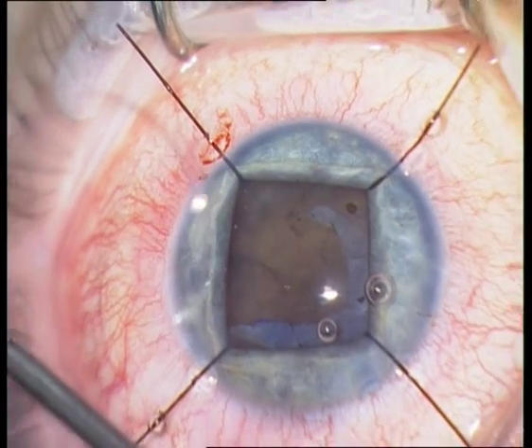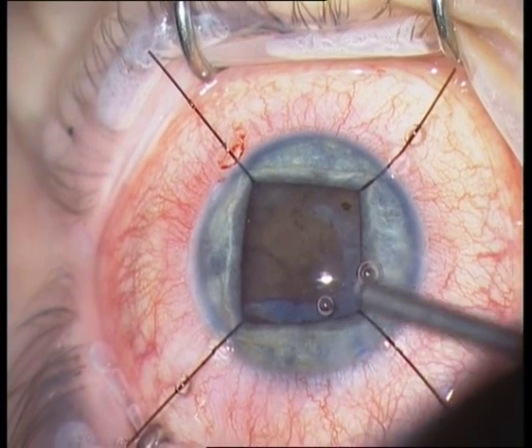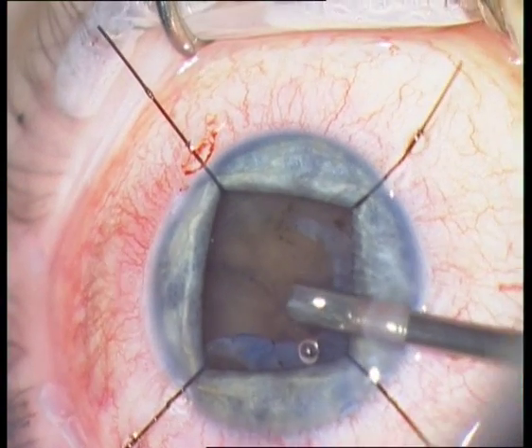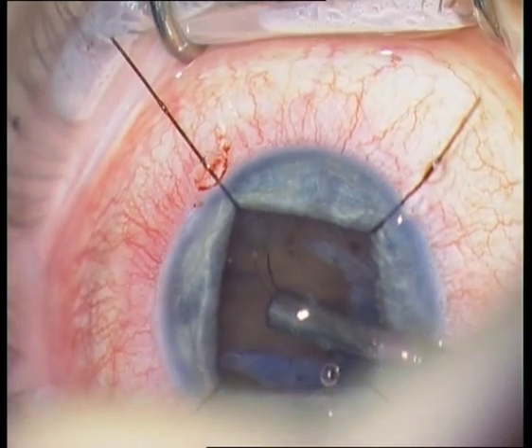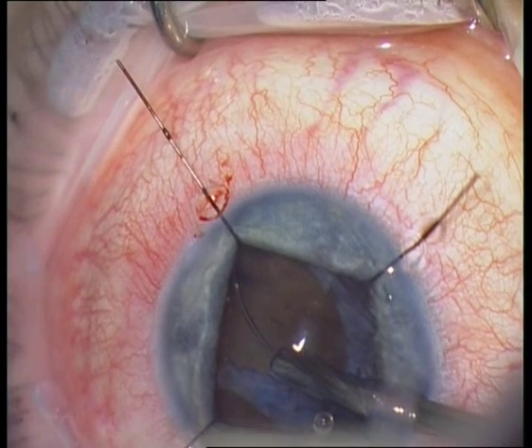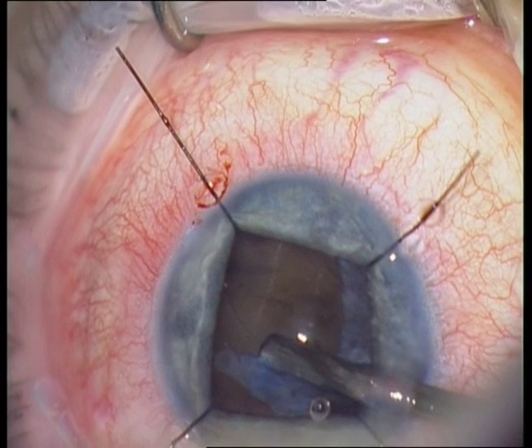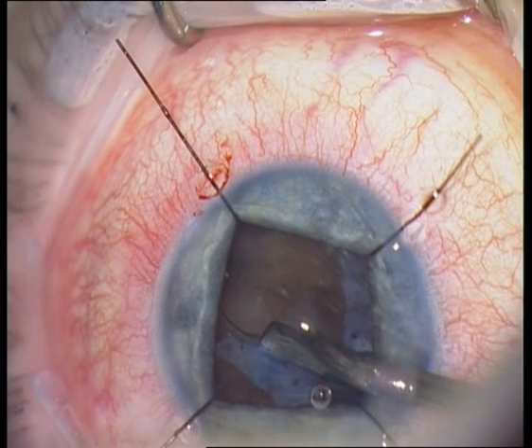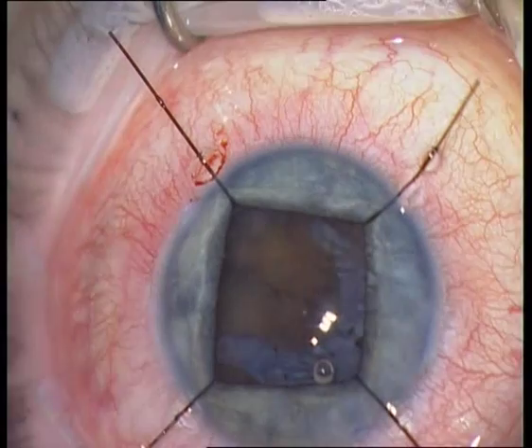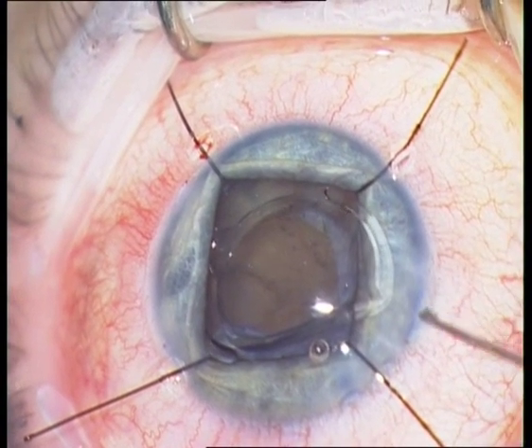The next step is the implantation of a capsular tension ring to stabilize the lens capsule, which has some zonular lysis. This is a preloaded capsular tension ring — very easy to use. Just be sure that the beginning and the end lie inside the lens capsule.